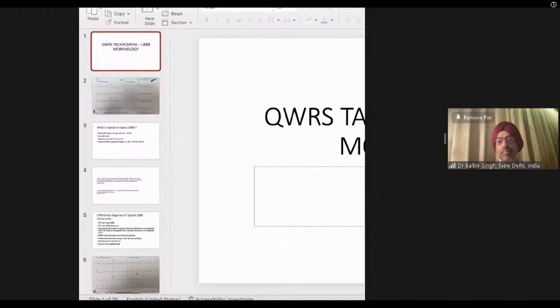So the late PAC is when the HIS A is getting activated. Roughly, you look at the A in the HIS, and at that time deliver a PAC at the level of the possible insertion site of the pathway, and then start scanning the cycle.